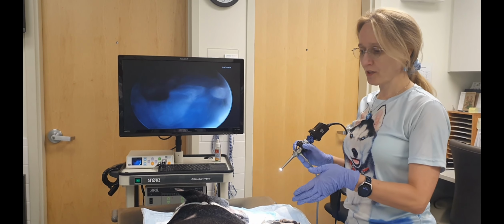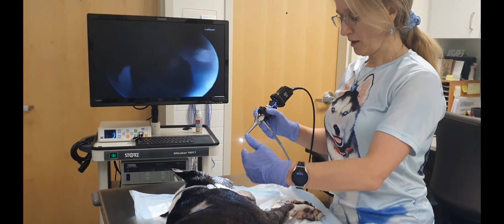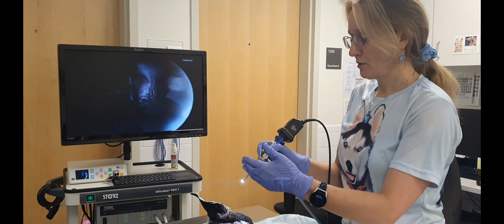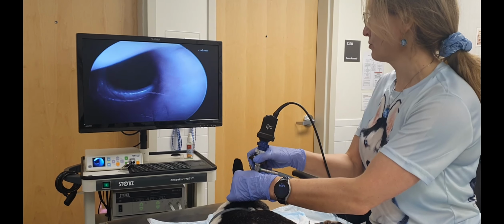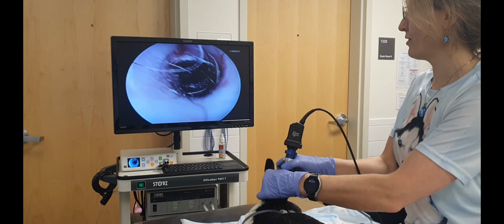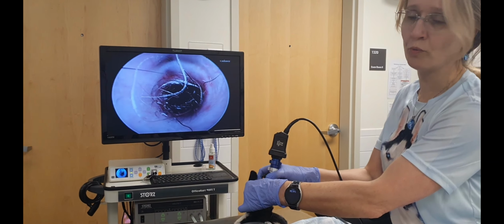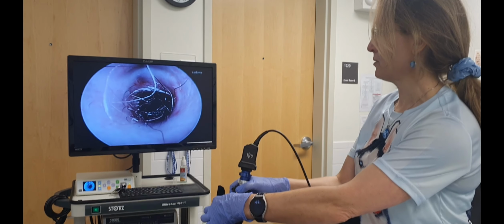Another position is lateral, and in that position you can still be at the ventral side of the patient, so that will still provide you the most common view of the eardrum, because you're still going the same anatomical way: whatever is dorsal will be on the top of the screen, whatever is ventral will be on the bottom. But again, the same issue: you need someone to hold the pinna, or you need to do it yourself, and someone will operate the instruments, because you basically need two hands to do it.